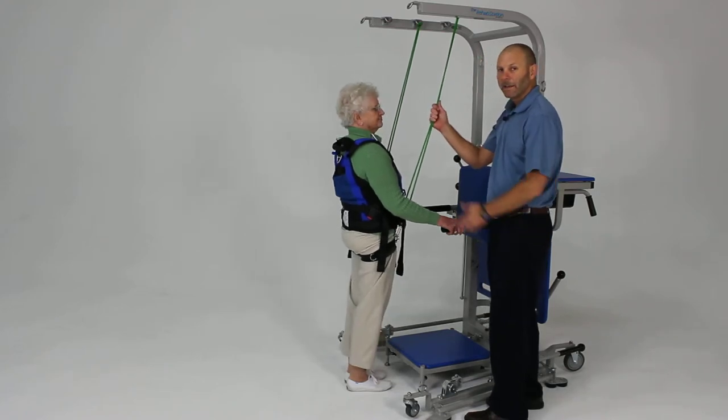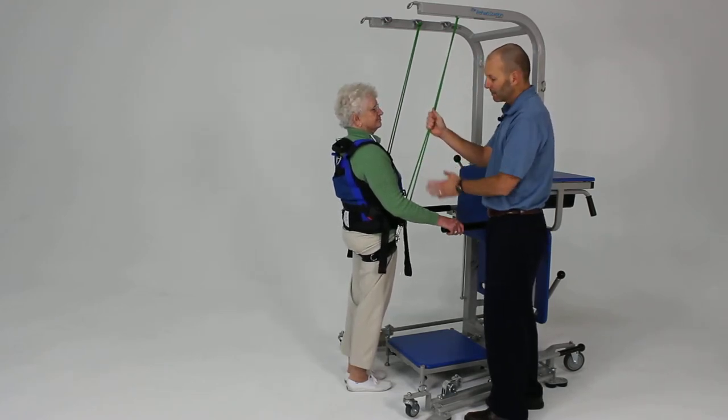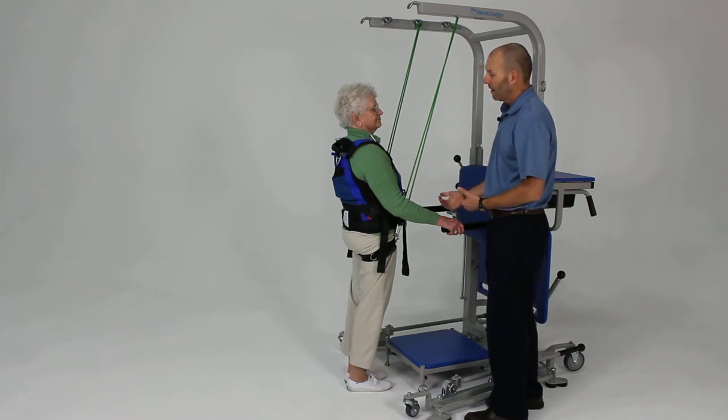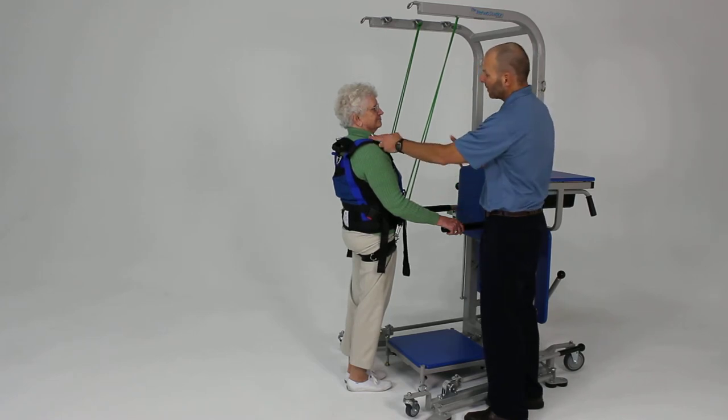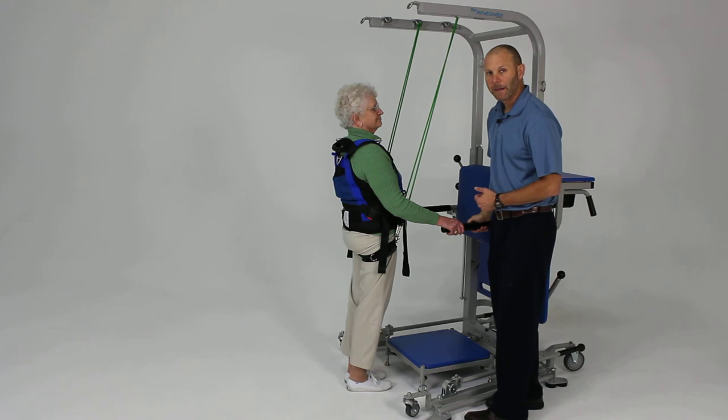We can progressively use thinner cords that provide less assistance, and eventually go without assistance. If you're concerned about them falling, we can also add in our safety lines — a static line that will prevent any loss of balance if you're concerned about that.